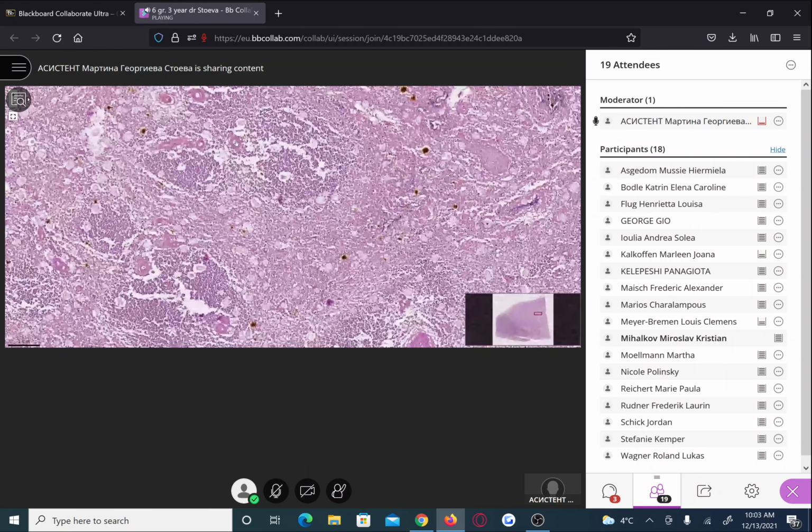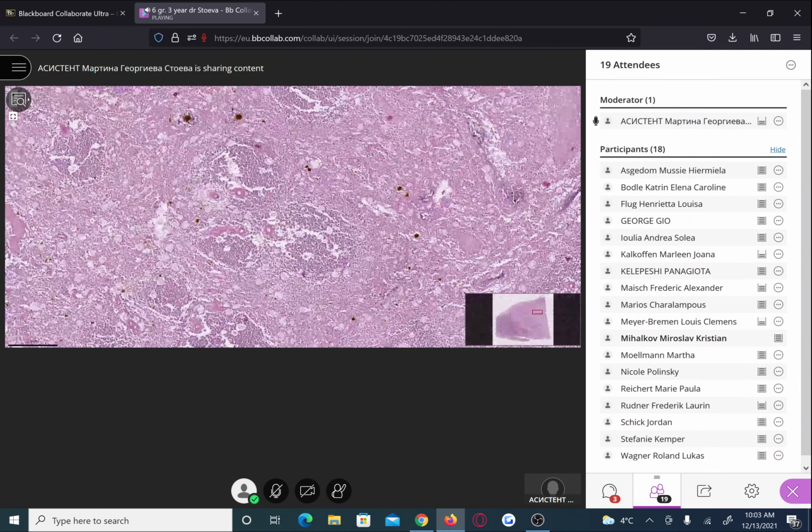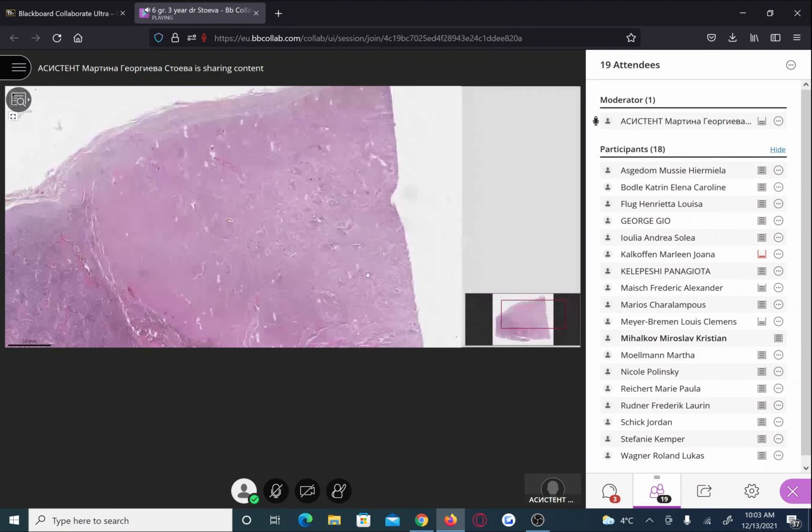So these shadows of structures still show us which is the organ because of the type of necrosis. This is coagulative necrosis, which is exactly characterized by the fact that the structures, or shadows of structures, are still preserved, although the cells are necrotic.